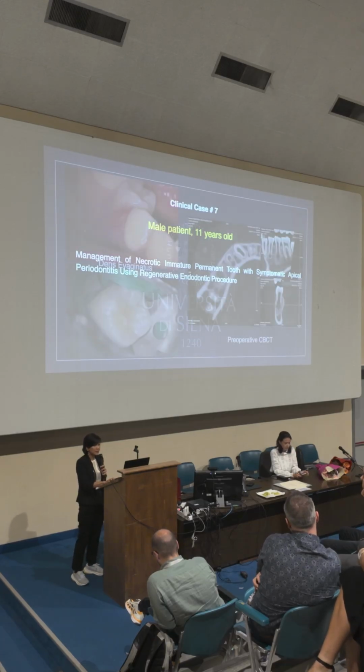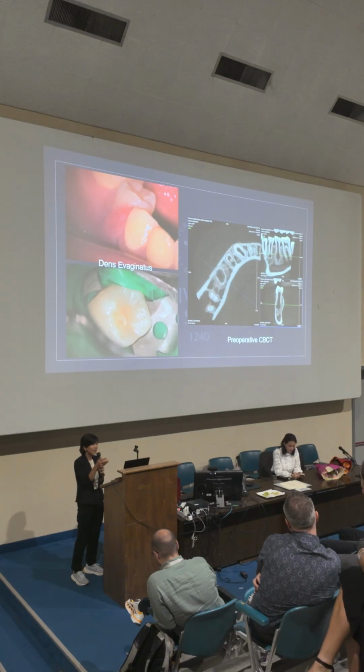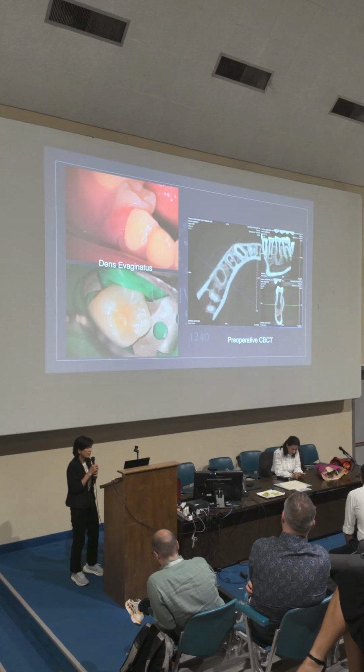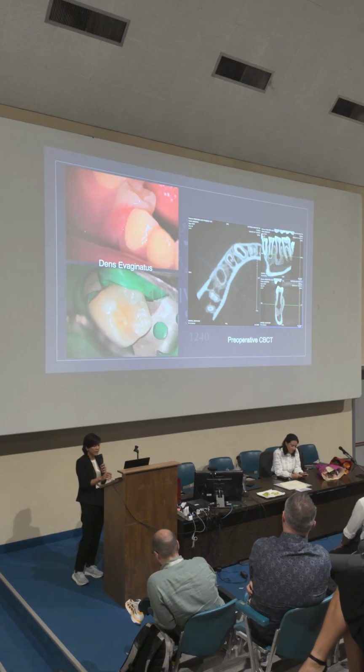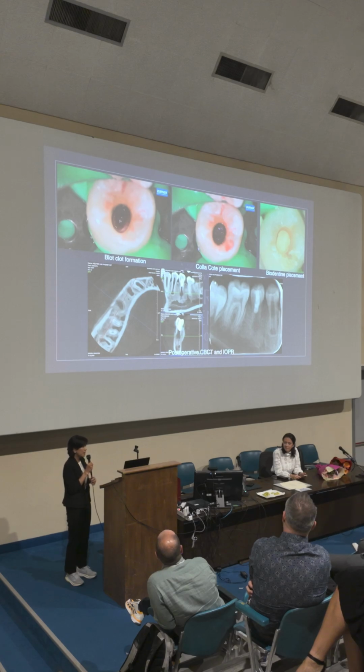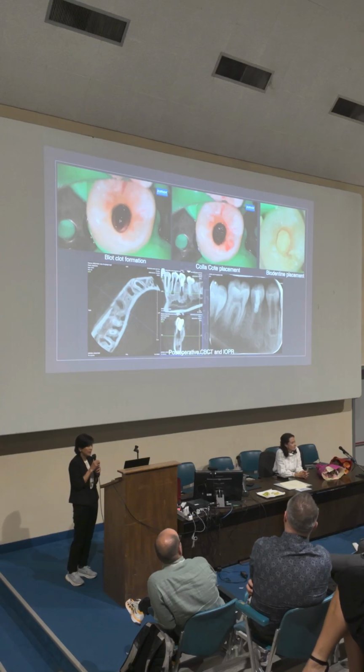endodontic procedure. And this is the case that I heard this morning, the same procedure with ESE with 2 appointments. The first appointment, I did the minimally invasive cleaning and shaping with 3% sodium hypochlorite and ultrasonic activation. And for the second appointment, I initiate the bleeding, and I have the blood clot under microscope within 10 minutes. And after that, I place the Biodentine, and after that, the final restoration with composite restoration in 1 visit.